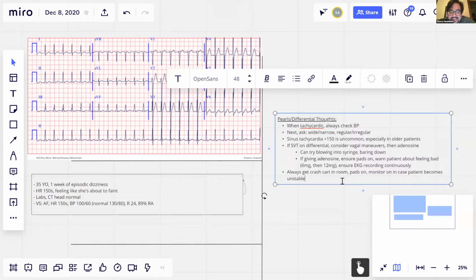The only thing I'll say is I'm probably the only person who loves giving adenosine. I know it's not super patient-centered, but the first time I did that as an intern with the ECG on continuous just blew my mind. The point Anne-Marie made at the end is so important. We get so into the algorithm that it's important to be able to revisit your diagnosis. Putting the ECG on continuous, just think about what adenosine does. You can basically isolate what's going on at the atria, and you'll get beautiful P waves with no interference that you can truly analyze. The only other thing I would mention is you want the IV as close to the heart as possible.